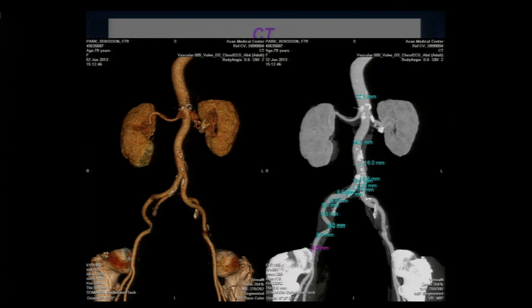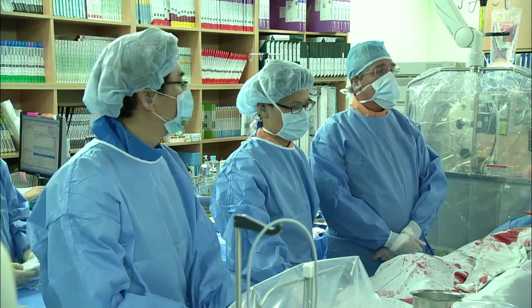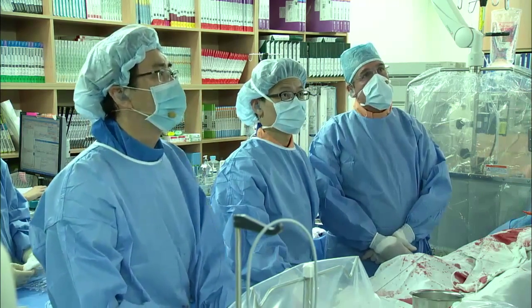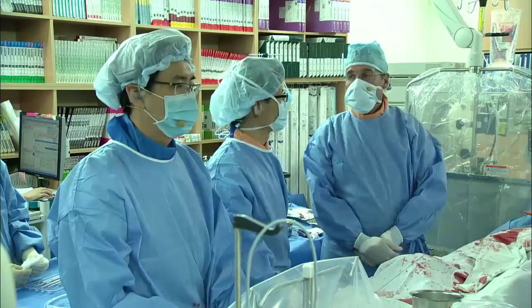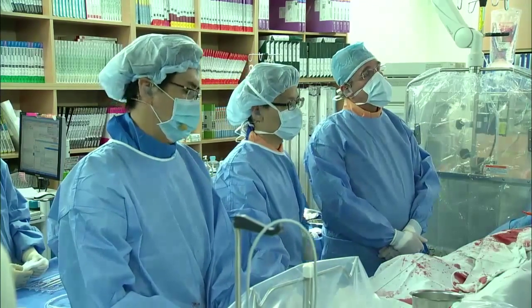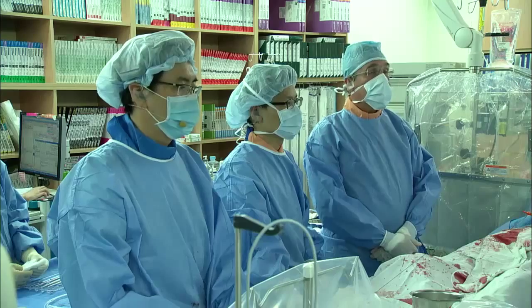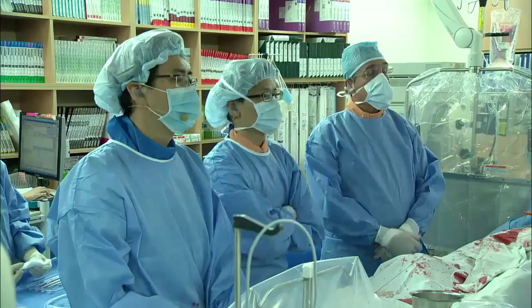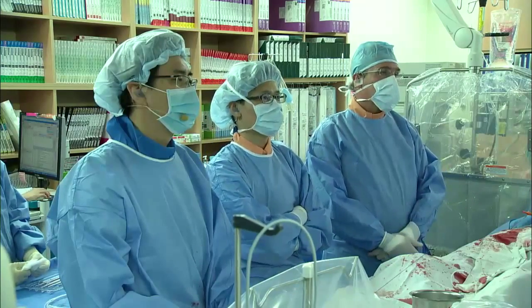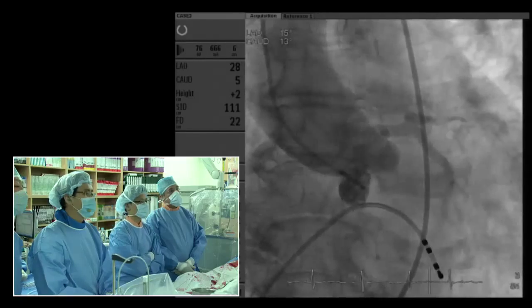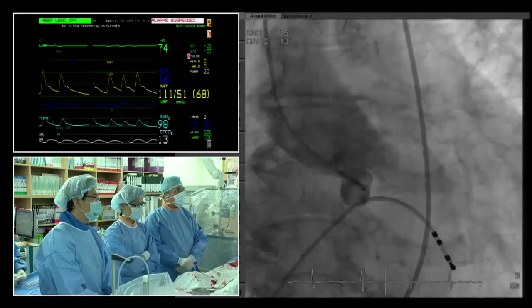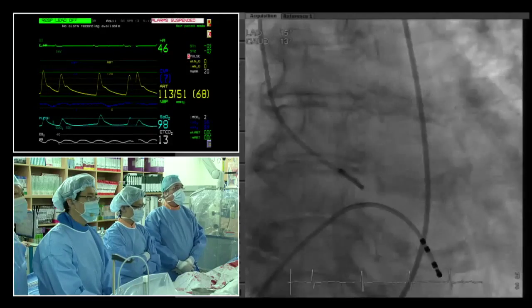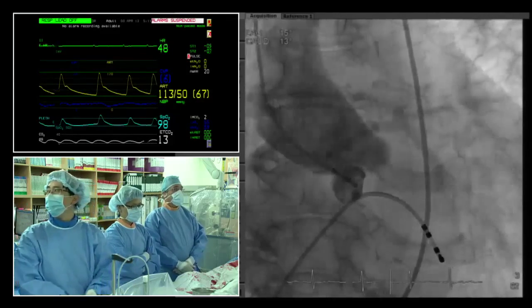Regarding strategy — thanks Kim for this information. Femoral access is straightforward, not much to discuss there. For valve sizing: the echo gives 19 mm which normally drives us toward a 23 mm valve, but coming back to CT — 19 to 22 mm, mean of 21 mm — it is a good strategy to go with a 26 CoreValve rather than a 23.